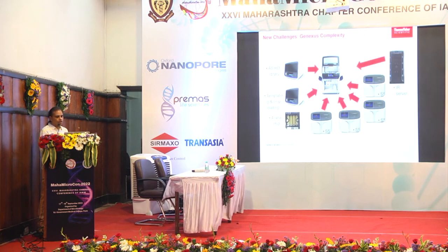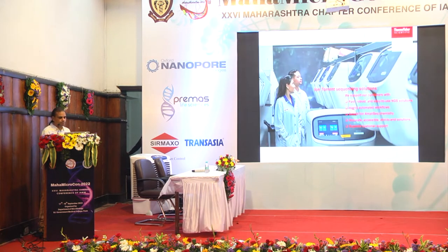So we have different options. All these options are available if you have a lot of manpower with you. If you want only a single point touch instrument, you can go for the GeneXus instrument.